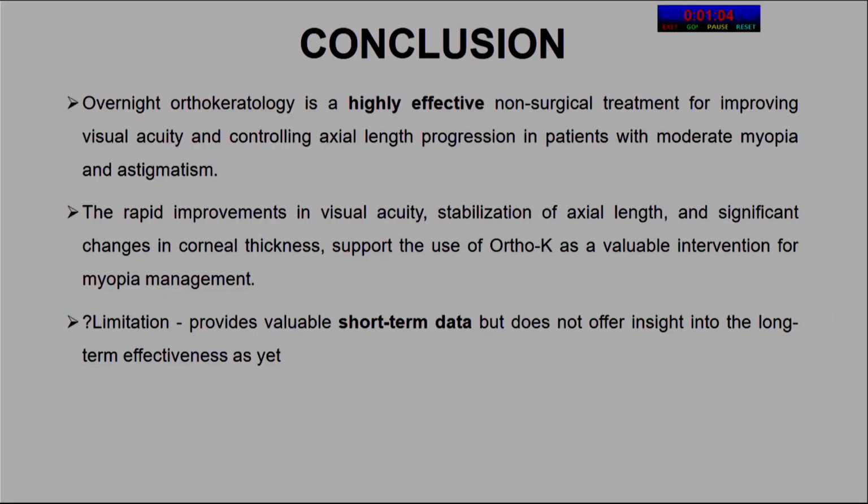To conclude, overnight orthokeratology is a highly effective non-surgical technique for improving visual acuity and controlling axial length progression in patients with moderate myopia and astigmatism. The rapid improvement in visual acuity, stabilization of axial length, and significant change in corneal thickness supports the use of ortho-K as a valuable intervention for myopia management.